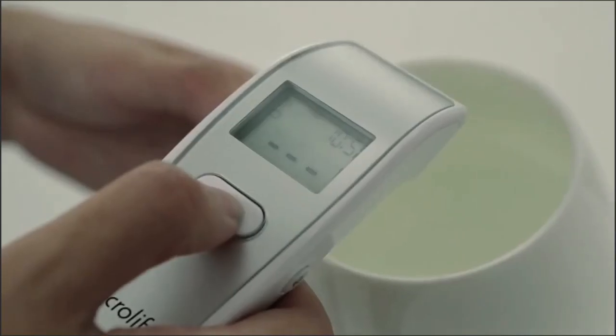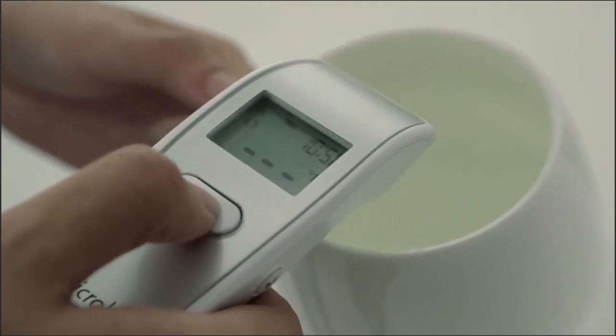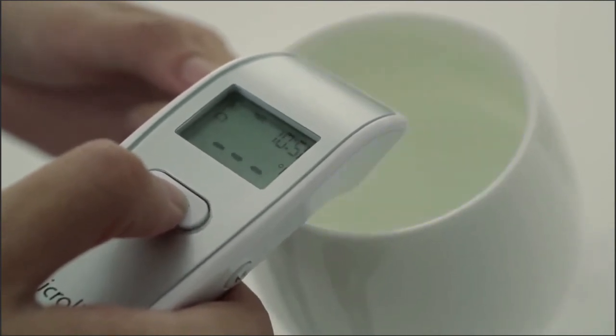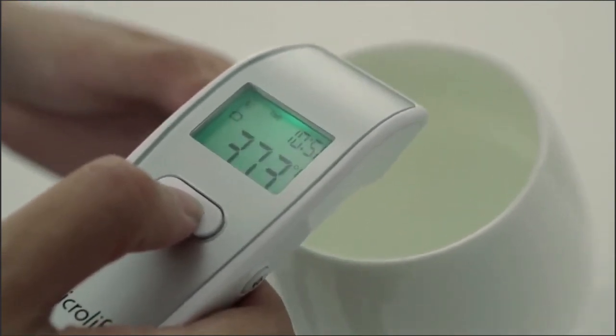Don't forget to take medicine with warm water. The Microlife Instant Forehead Thermometer is precise and multifunctional, and can also be used to measure object temperature.